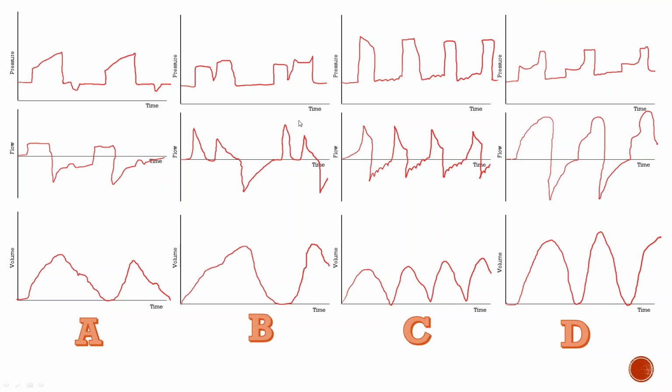The common misconception is that this... what would we identify this as? Yeah, like double triggering. The patient's just not happy with the low tidal volume and wants another breath and is getting greedy and gets a double trigger. It's a common misconception that this is the most common cause of dysynchrony, but it's not. The most common cause is actually A, which is called inadequate triggering.